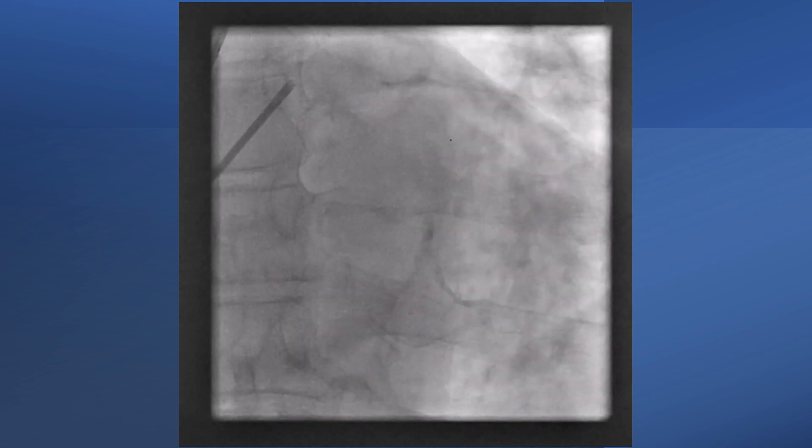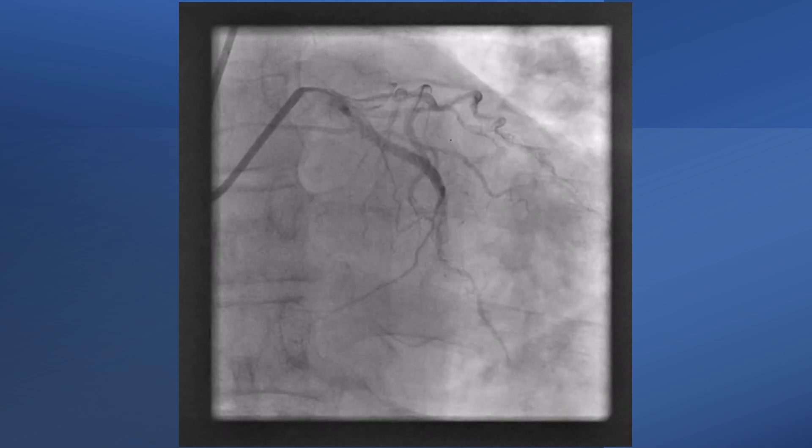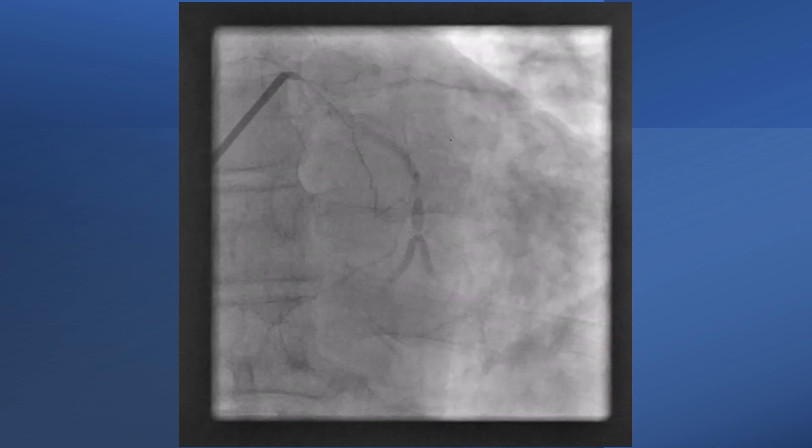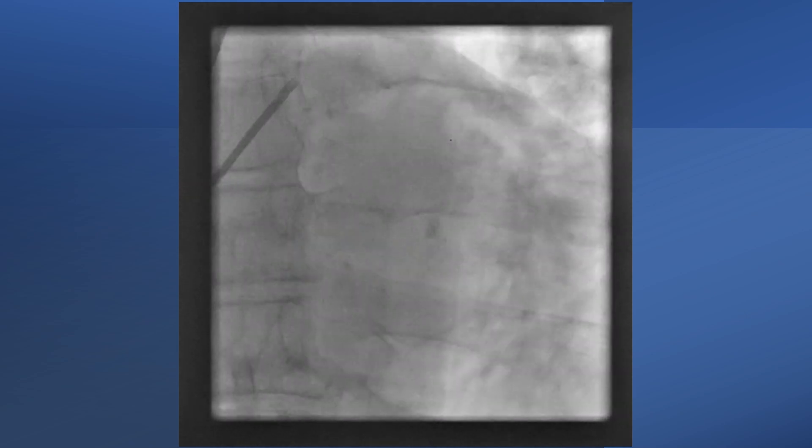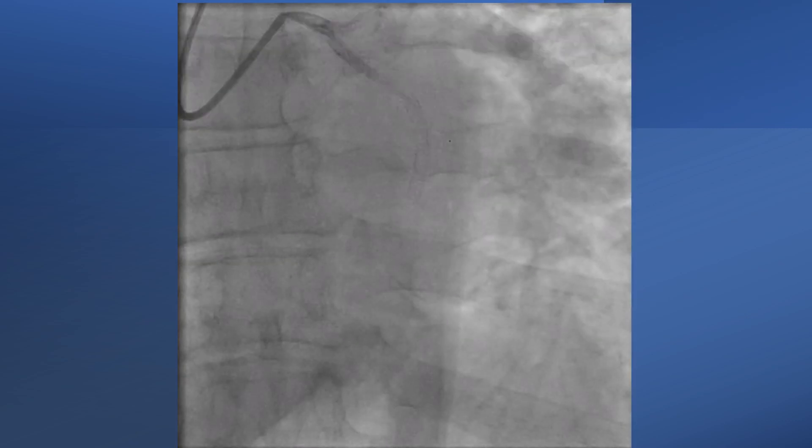The flow was compromised and the patient had chest pain. At this point, we were lucky because the dissection segment was short and stopped at the bifurcation. So we resorted to a Pilot 200 wire technique to puncture the flap, and the artery was saved.